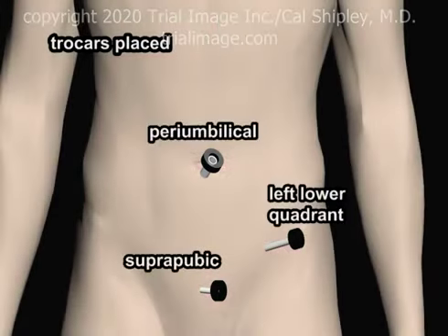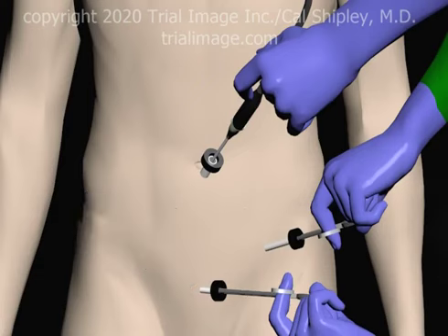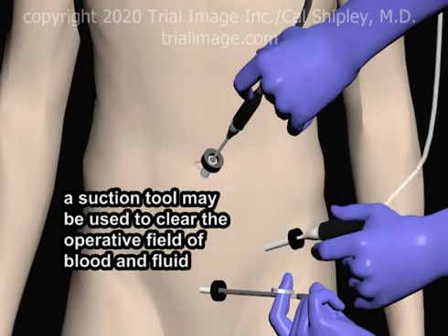Although there are several variations, the setup of ports and trocars I have depicted here is fairly typical, with placement in the periumbilical region, the left lower quadrant of the abdomen, and the suprapubic area. The left lower quadrant and suprapubic ports are used for surgical instruments. One of the instrument ports may be used for a suction tool to remove blood and excess fluid from the operative field as needed.